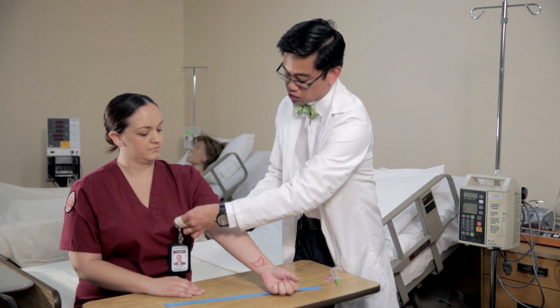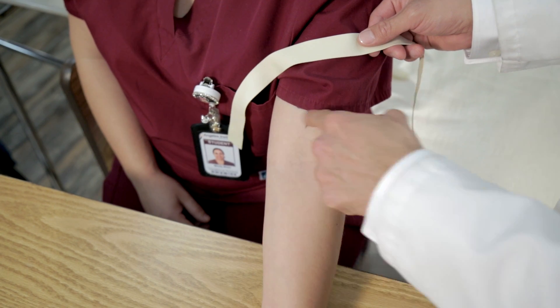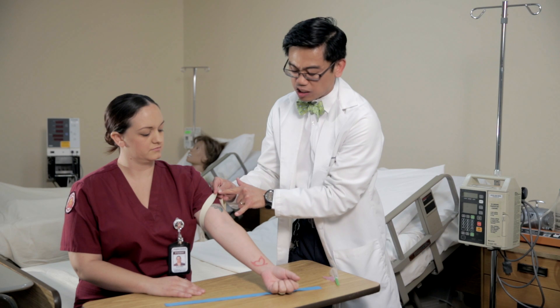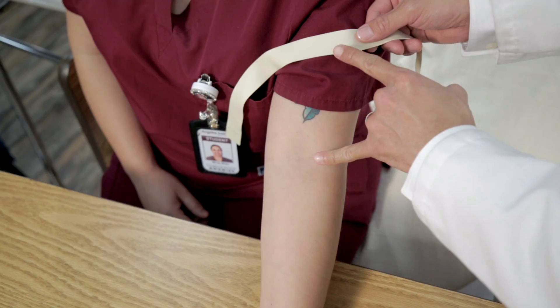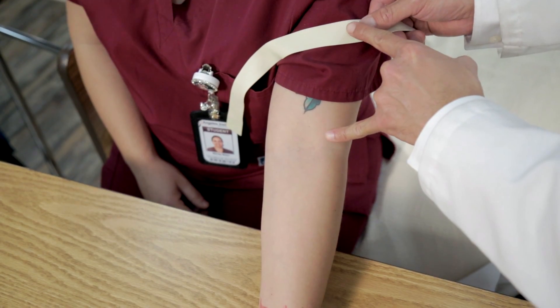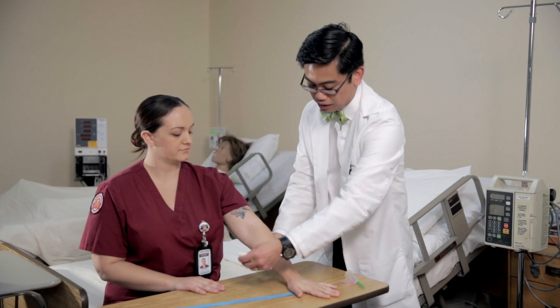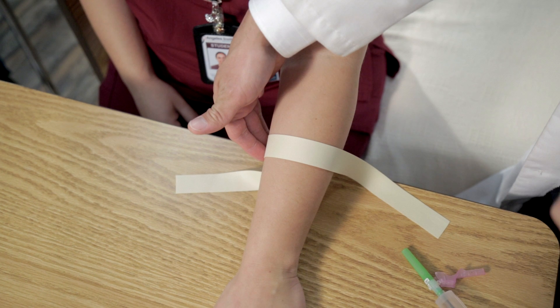If the intended puncture site is to be in the antecubital area, you want to first put the tourniquet approximately four to five inches above the antecubital area. If the intended puncture site is behind the hand, you want to put the tourniquet midway on the forearm.